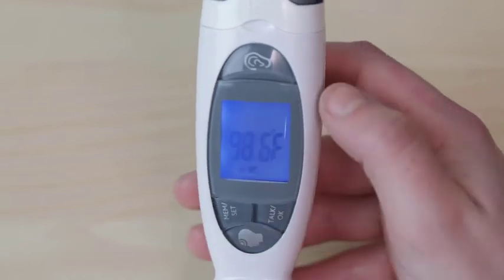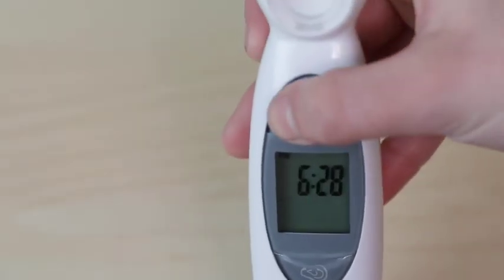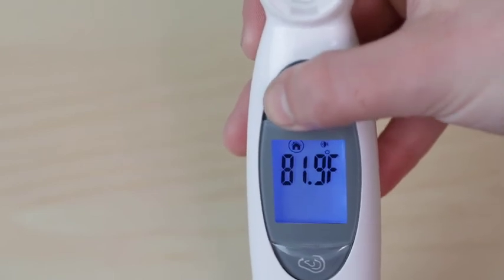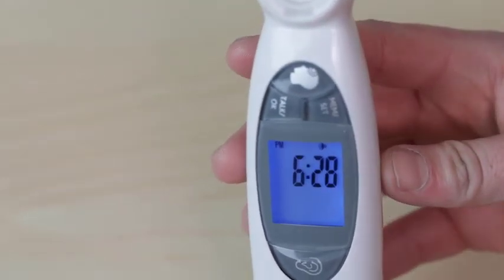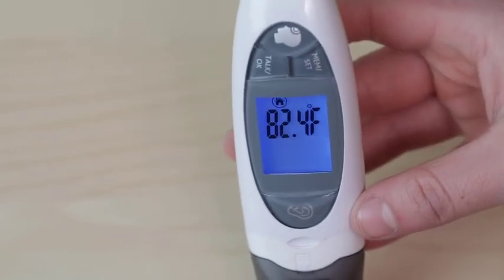To exit the memory mode, press the ear and forehead buttons simultaneously. To disable the talking function or change the language, press and hold the talk OK button for two seconds. The device will beep and display the next voice option. Continue doing this until you land on your preferred language, or stop on the screen with two dashes if you would like to turn the voice prompt off.